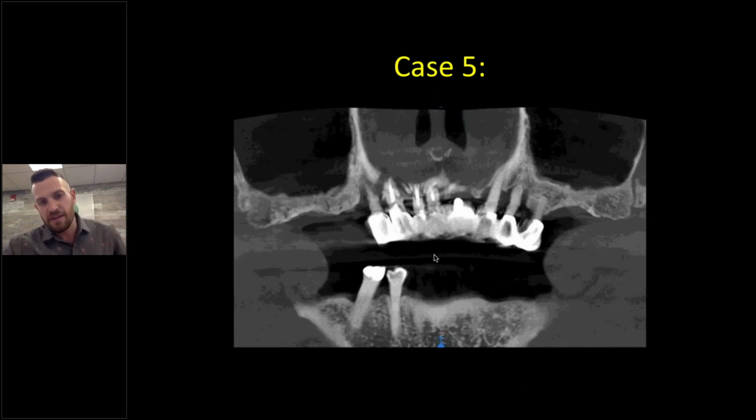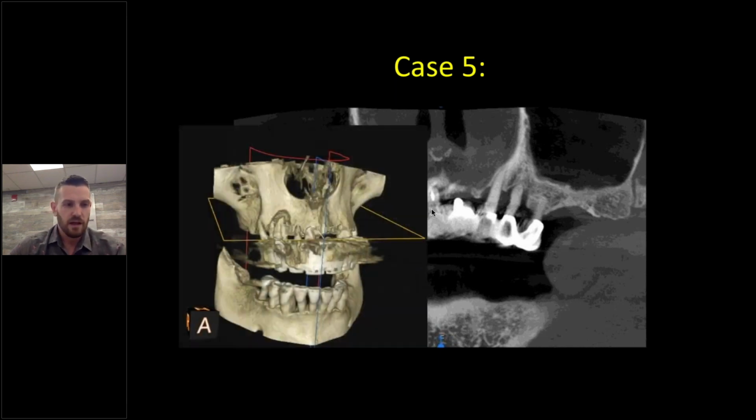Another case that was done utilizing this bone membrane was an all-on-4, or I like to call it an all-on-X type procedure, where a hybrid actually was not placed day of. Based off of the pano that you can see, there's quite a bit of bone loss around a lot of the dentition. So, terminal dentition, and the patient elected to place implants and, if stable, convert to a hybrid. But since so much bone loss was present, that was not really anticipated.